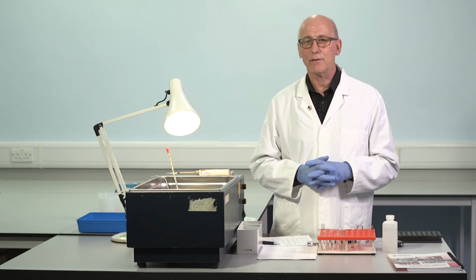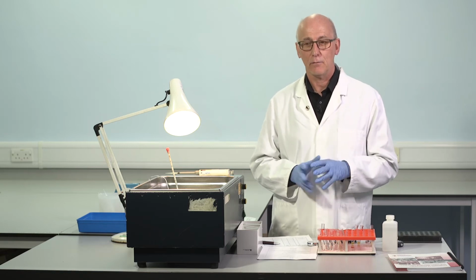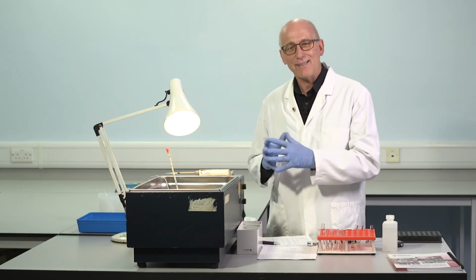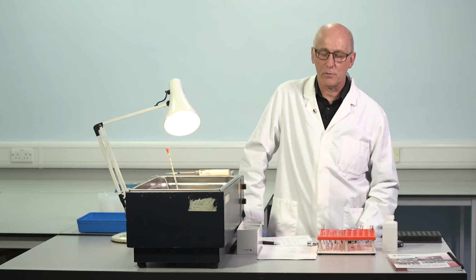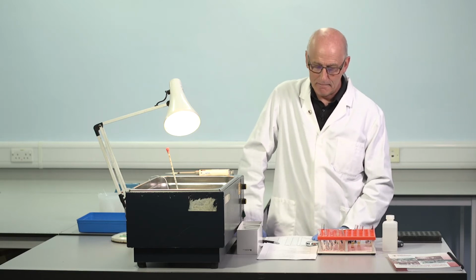If we do that, we take away this interfering effect. And that can have an important impact on the accuracy and on the precision, but particularly the accuracy of the result. We'll come back to that point when we look at some calculations. So if we use a sensitive reagent, a reagent with a low phospholipid concentration, then we permit much more easily interference from lupus anticoagulant, and that can cause us significant difficulties in the assay.